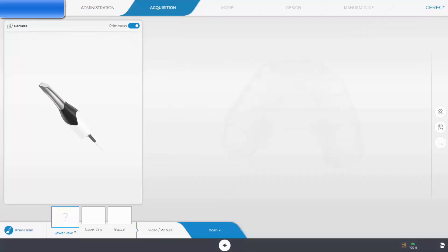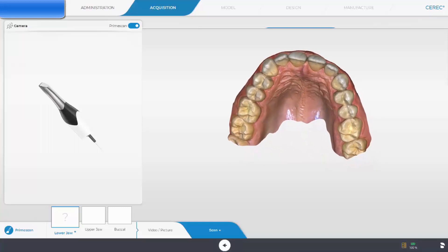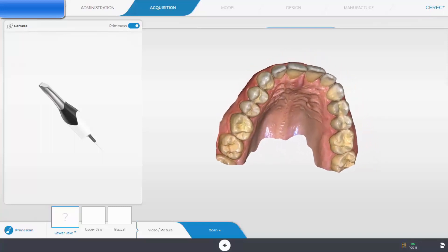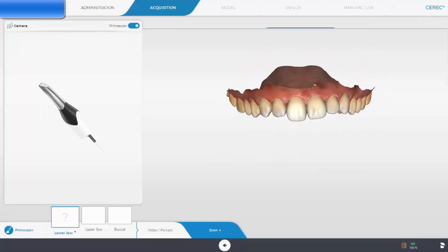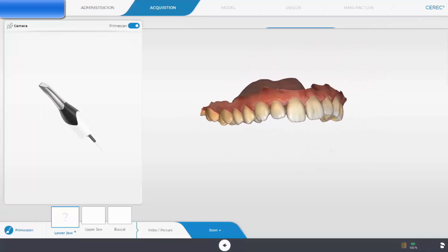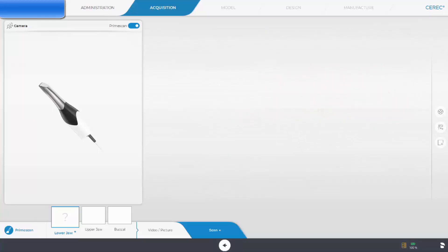The CEREC PrimeScan is not only an incredibly accurate scanner, it has novel smart scanning capabilities that will clean your model in real time as you are scanning. There's no need for any tools to cut out bad scanning areas as the software does it automatically. This means no more lips, cheeks, or tongues in your scan.